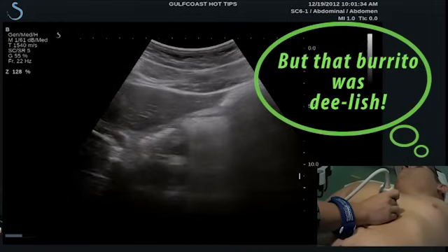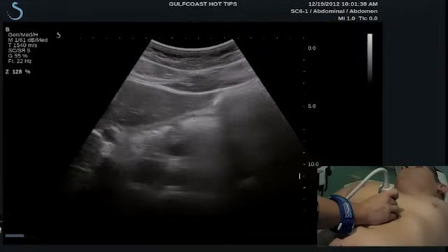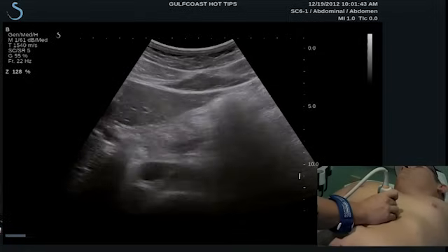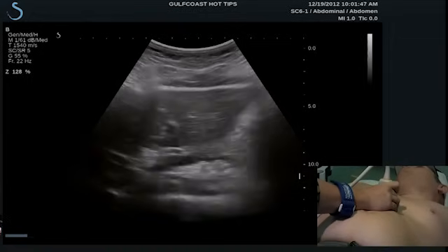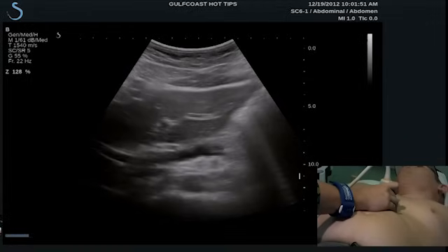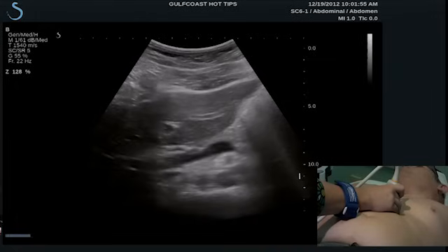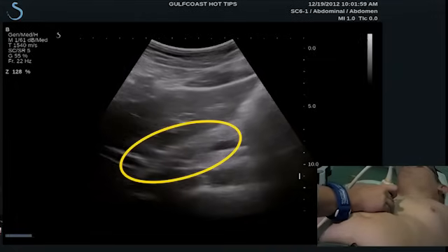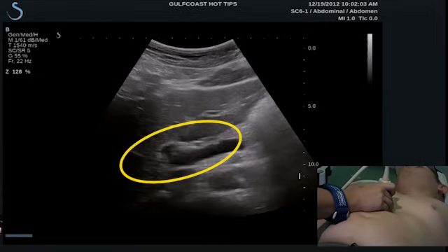What you can do, again, is in transverse, angle down until you can locate that comma-shaped structure, the portal splenic confluence, and asking the patient to slowly push their abdomen out like a ball will displace the gas and once again allow you to elongate that portal venous segment and appreciate the area where the common bile duct is coming out of the liver and coursing towards the pancreatic head.